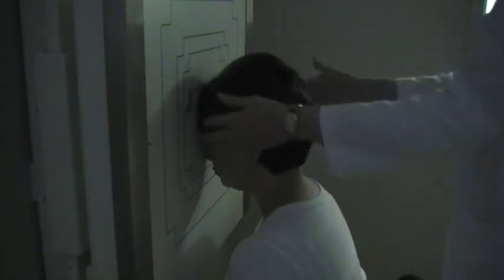Make sure it's centered and the midsagittal is lined up. Mark the correct side of the body — this is the left side, so we're going to put a left marker. Whenever there's an injury to a particular side, especially in the lateral, you want to place the affected side to the board because you'll see better detail to that side. For sinuses, instead of using the 15-degree tube angle, you can also do the Caldwell method by bringing the forehead off the board and just having the nose touching — in the axial projection, you'll have a 15-degree tilt of the head instead. You're accomplishing the same thing; it's still considered a PA axial.